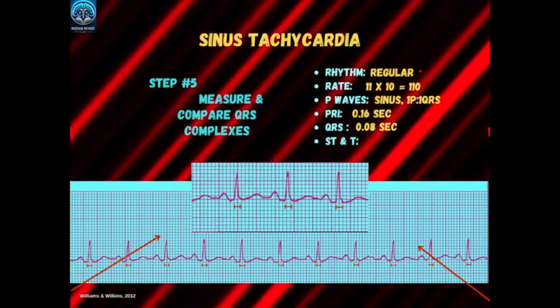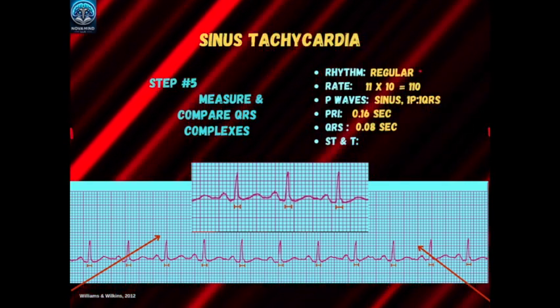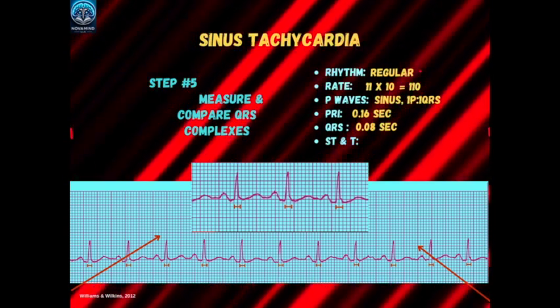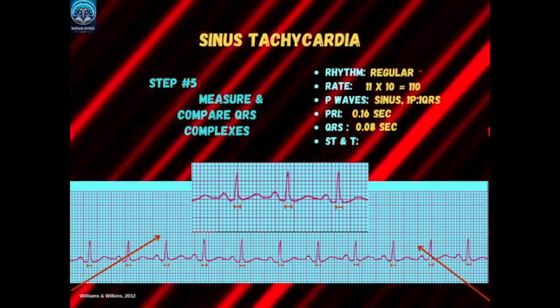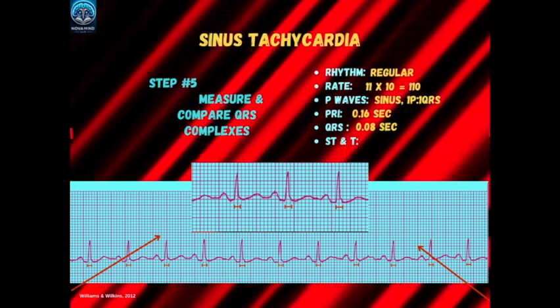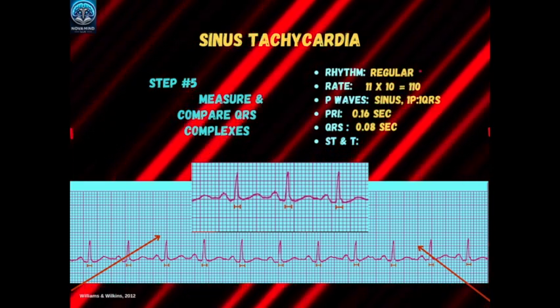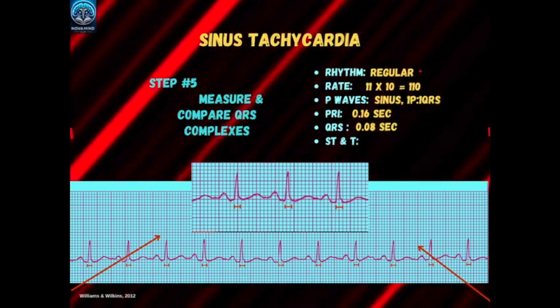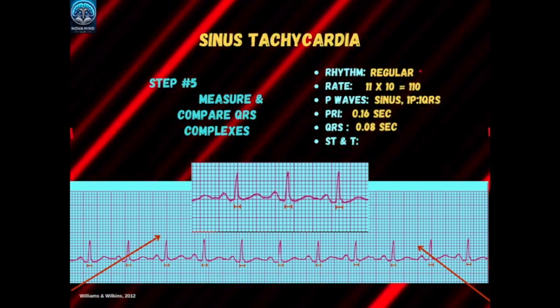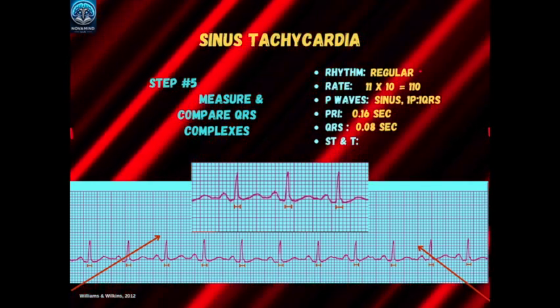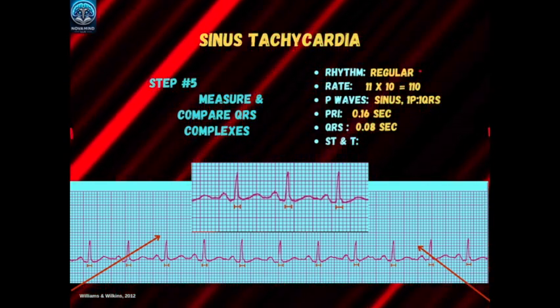Step 5 is to measure the QRS interval. The QRS complex measures two small boxes, which multiplied by 0.04 seconds gives a QRS width of 0.08 seconds. Comparing all QRS durations on the six-second strip shows a variation of 1.5 to two small boxes, giving 0.06 to 0.08 seconds for the QRS complex durations. Since the difference is only half a box, the QRS interval is still considered normal.